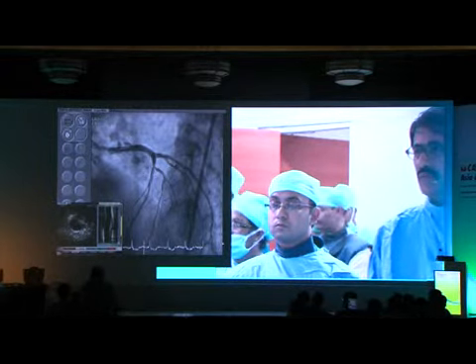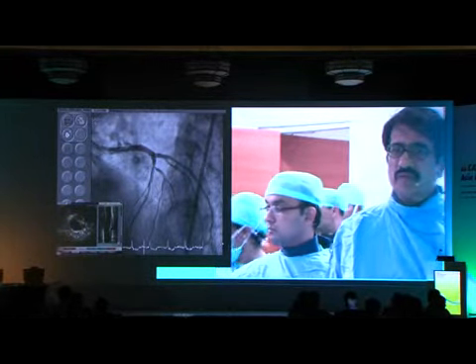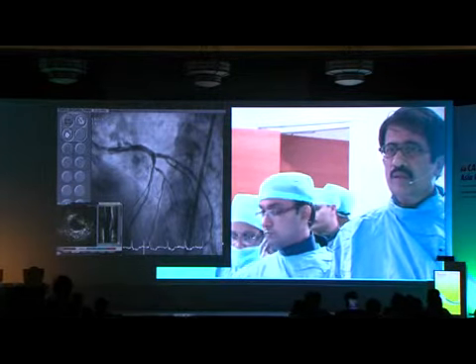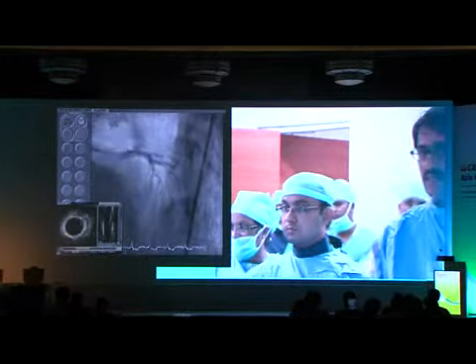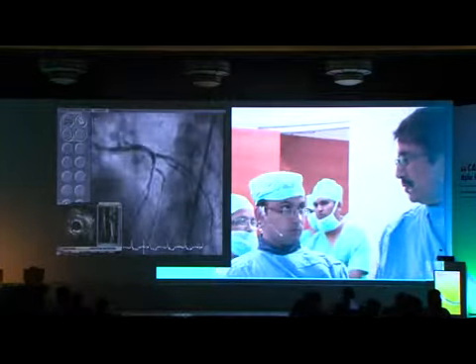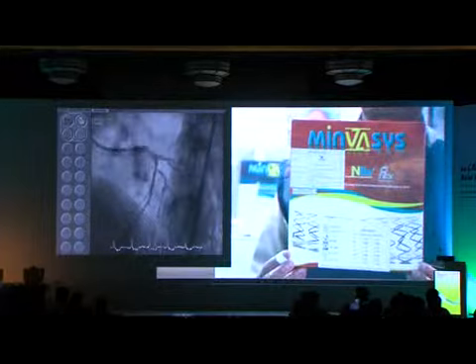It's pretty convincing to me that we have a significant lesion. So we go back to the cine. And what we propose today is a dedicated bifurcation stent. Can we see the box of the... so this is Nile Pack's dedicated bifurcation stent.